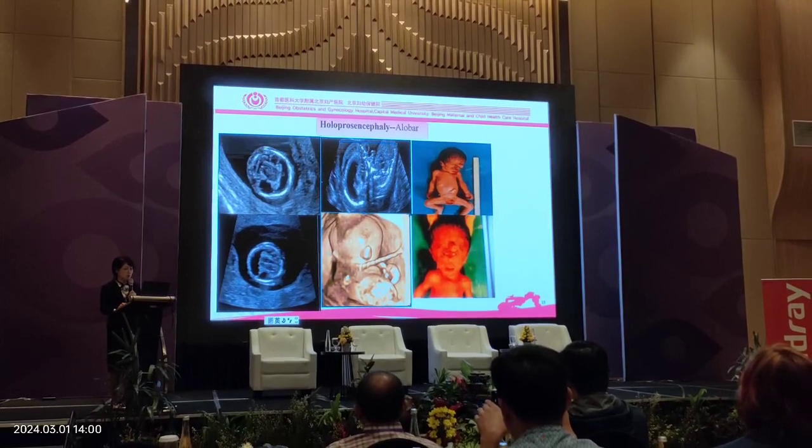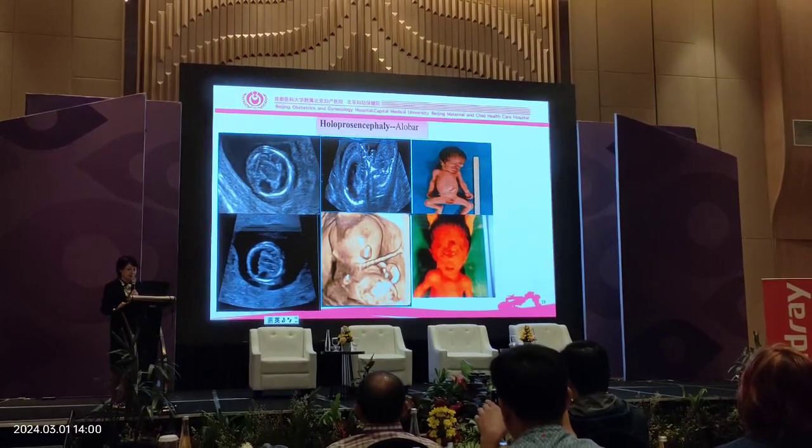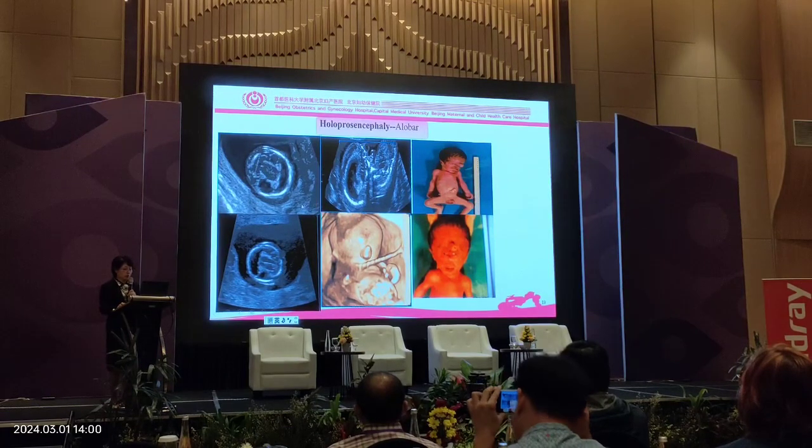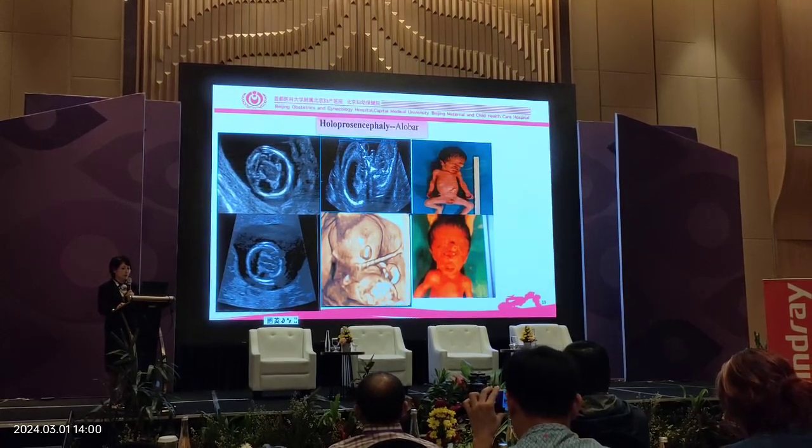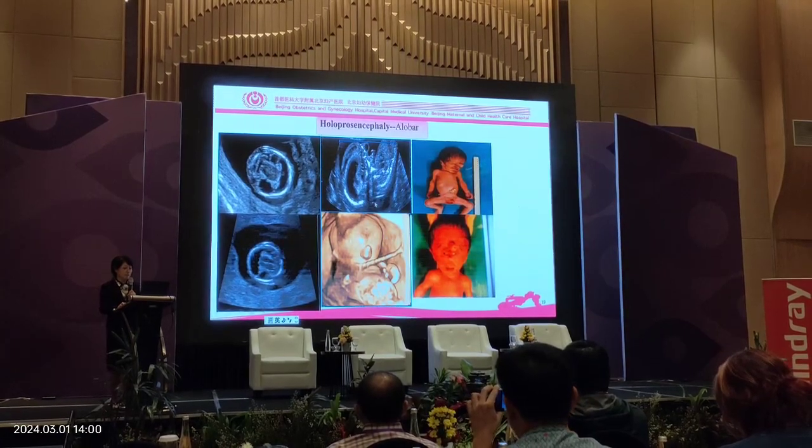Nose, mouth, usually we can see abnormalities. So in total, holoprosencephaly syndrome, usually we give the diagnosis.